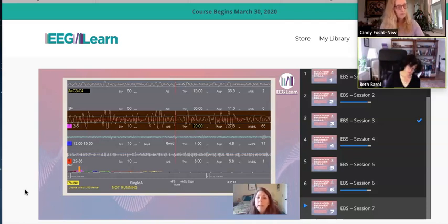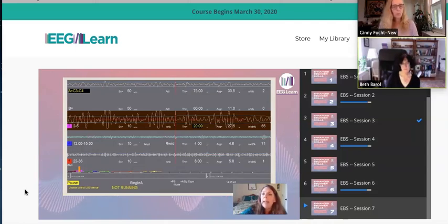And then that frees us up to put most of the emphasis of our training on the slow wave inhibit. So again, I've put the limbo bar in microvolts at least a little bit lower than the average amplitude is currently coming in.